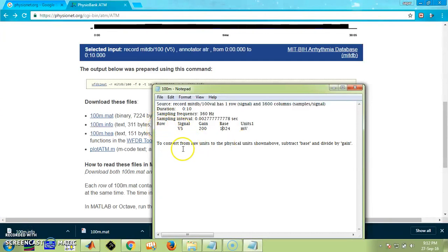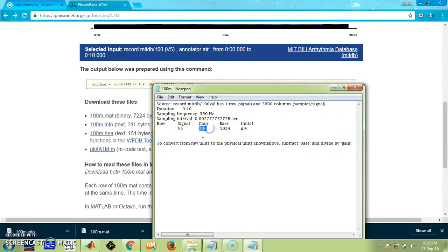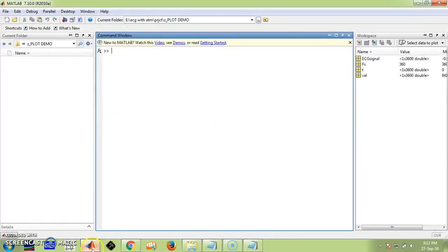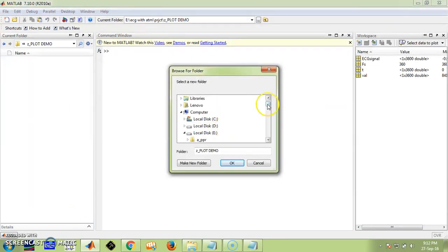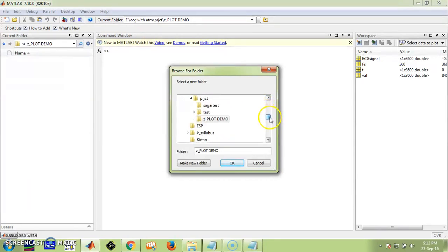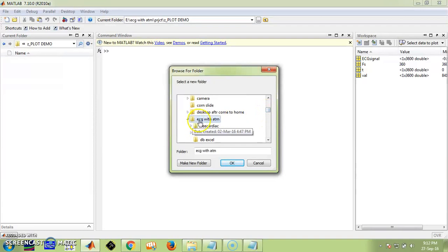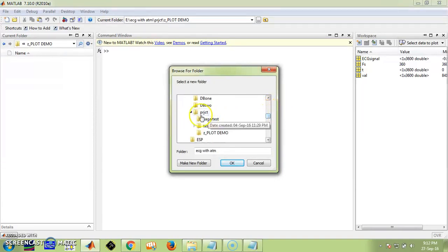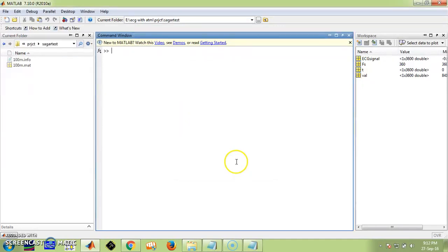The database available is in raw units — we need to convert it into millivolt samples. For that, we need to subtract the base and divide by the gain, which is 200. Now go to MATLAB and choose your directory where you have stored the database. I have stored it in the ATM project folder. Select the folder and the downloaded .mat and .info files will be visible.